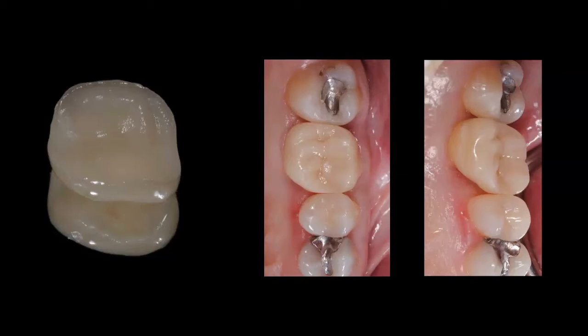Now I get this question all the time. I share with you that I normally do my etching process so I try in the restoration and I etch it after my trying. But I want you also to know that you can get all this ready. You can etch the restoration, you can clean the restoration, you can silanate the restoration, and you can have it now protected with the silane, and then move forward with your trying, rinse and dry, and then go to the next step, which is going to be your cementation, which we're going to talk about in a couple of minutes.